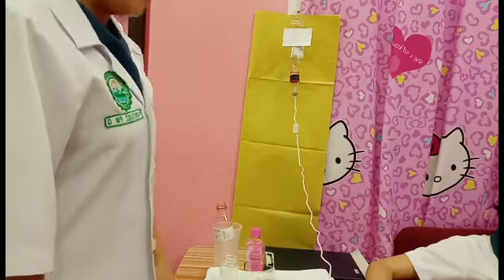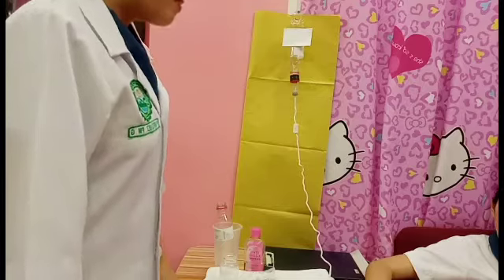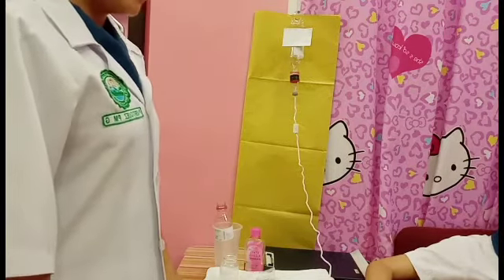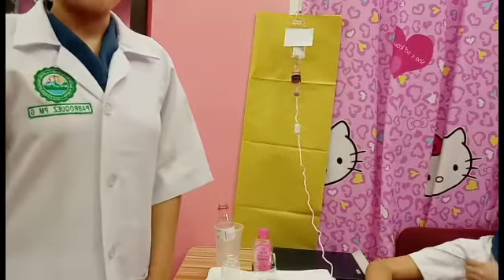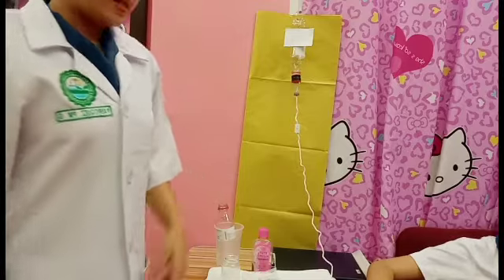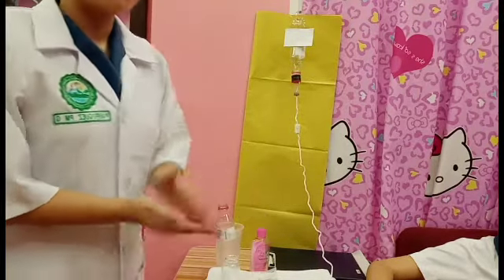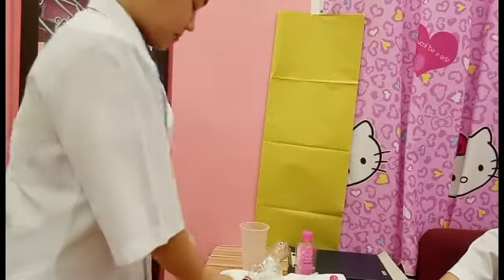So magandang umaga po, ma'am. Ako po si Perlin Pabroques, isang student nurse. Pwede ko po bang malaman ang pangalan niyo? Marie Chris Gomez. So magandang umaga po, Miss Marcus. Ngayon po ay papalitan po natin ang IV tube niyo. Then, wash your hands to prevent passing of microorganisms. And then, wear gloves.